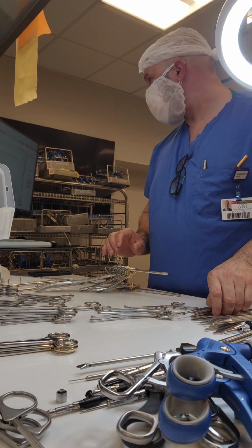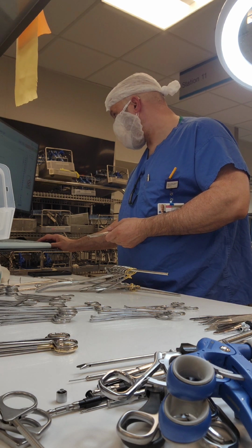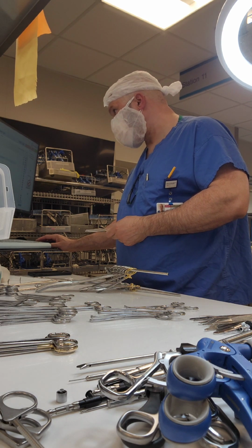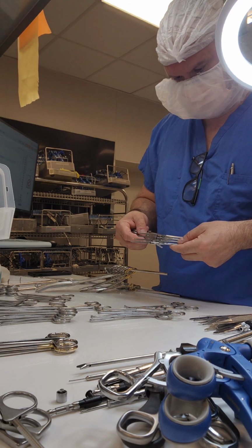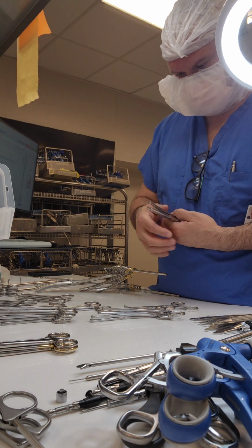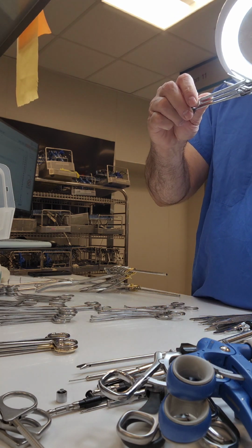Okay, and moving straight down the line, right? Now, I do a few instruments and then I acknowledge it on my count sheet. That way I never lose my place. So I probably do 2, and I'm always looking one ahead. That's what's going to build up your speed when you're assembling your trays, is always look one line ahead, right?